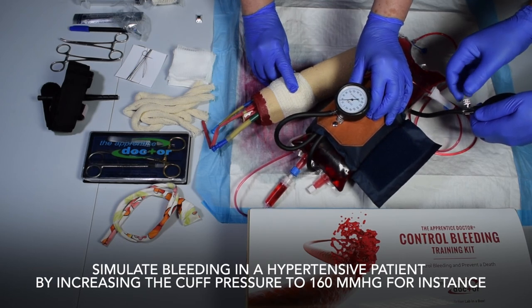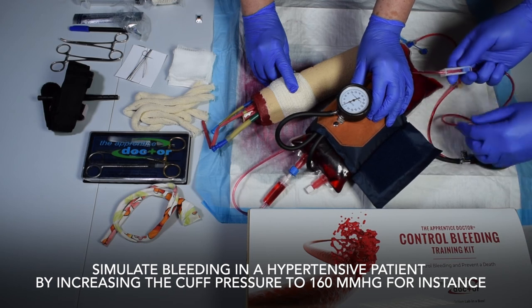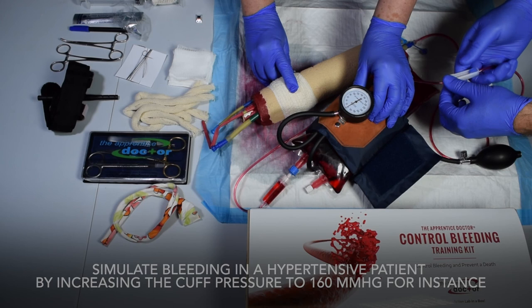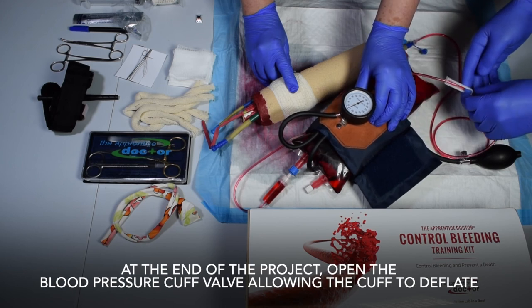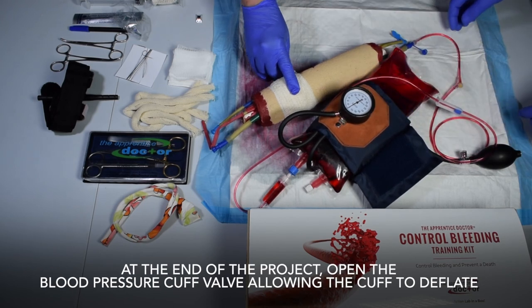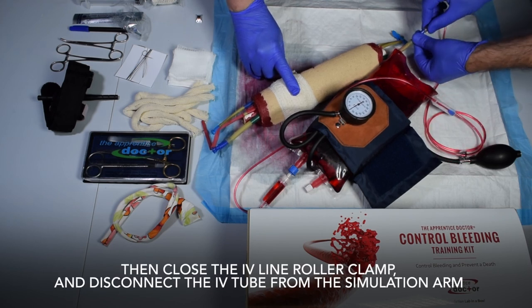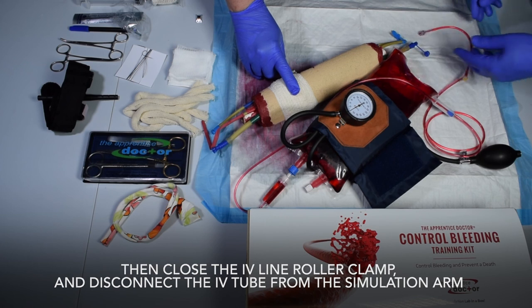Simulate bleeding in a hypertensive patient by increasing the cuff pressure to 160 mmHg, for instance. At the end of the project, open the blood pressure cuff valve, allowing the cuff to deflate. Then close the IV line roller clamp and disconnect the IV tube from the simulation arm.